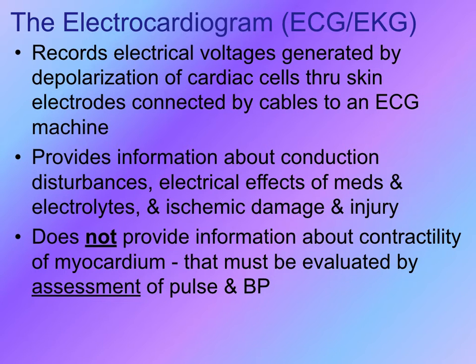It does not provide any information about contractility of the myocardium. That has to be evaluated through patient assessment, looking at pulse and blood pressure.